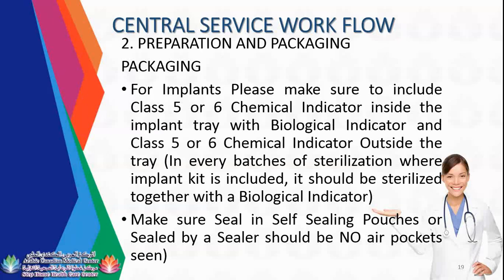Plus the biological indicator, and once you close it, you still need to put class 5 or 6 outside the tray. Why? Because your nurses and the user need to check, without opening the pouch, that this pouch was exposed to steam. So that's the purpose of your chemical indicator. Once the chemical indicator changes from blue to black, it doesn't mean your instrument is sterilized. It only means your instrument is processed in the autoclave. It was sent to the autoclave.